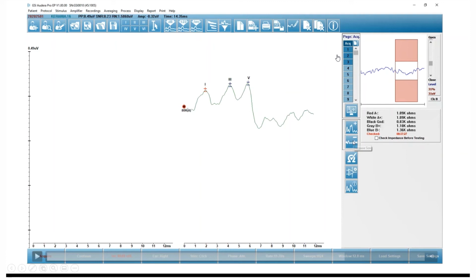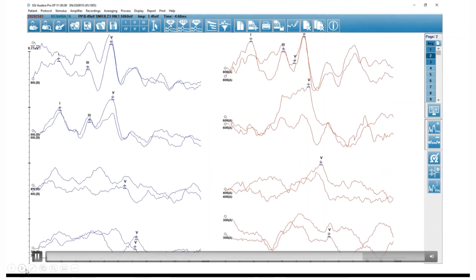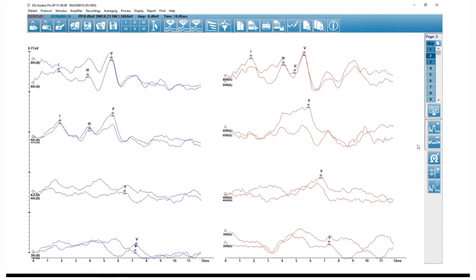Page 2 is the ABR data collected in both ears at 80, 60, 40, and 30. So you'll be able to see all the waveforms on the screen. You can sort them according to dB, which is what I will do, and then I will adjust the size of the waveform so they fit nicely on the page. So I'm going to go ahead and start the recording again, and I'm going to navigate over there to page 2 so you can see all my waveforms. I'm going to sort them and then make them a little bit smaller.